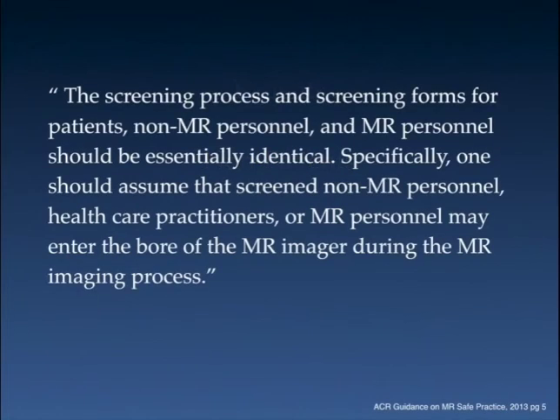The ACR Safe Practice Guidance document says that the MR screening process and the screening forms for patients, non-MRI personnel, and MR personnel should be essentially identical. Specifically, one has to assume that any screened non-MRI personnel, healthcare practitioners, or MR personnel, and this would also include parents accompanying children, may at any given time enter the bore of the MR imager during the imaging process. For example, a parent accompanying a child may reach up into the bore to comfort the child or hold the child.